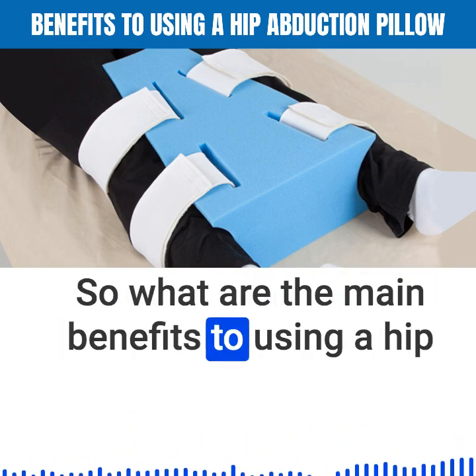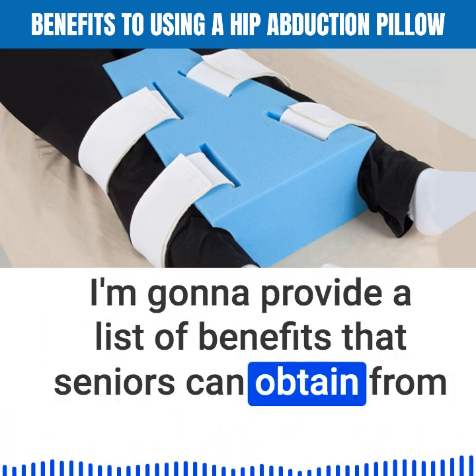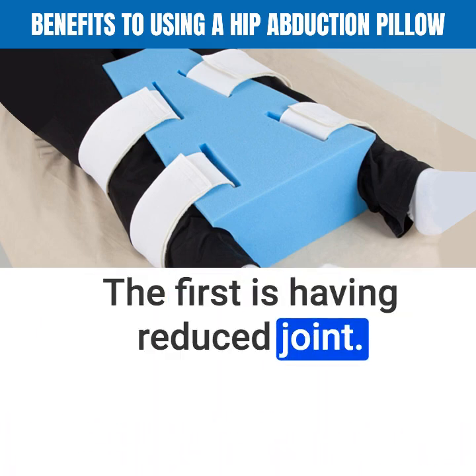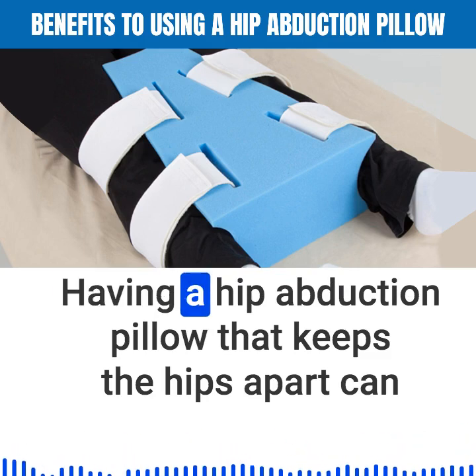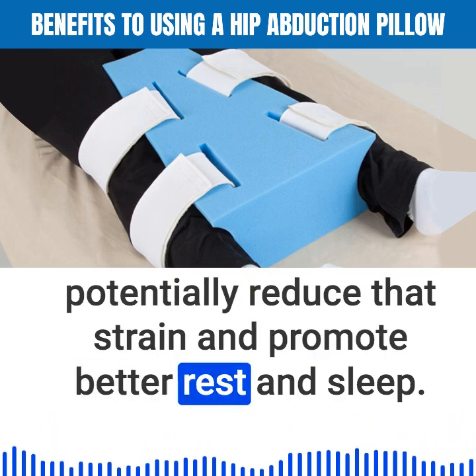So what are the main benefits to using a hip abduction pillow for seniors living at home? The first benefit is having reduced joint pain. Lying down with the hips pulled inward can cause a lot of strain on the hip muscles and joints. Having a hip abduction pillow that keeps the hips apart can potentially reduce that strain and promote better rest and sleep.